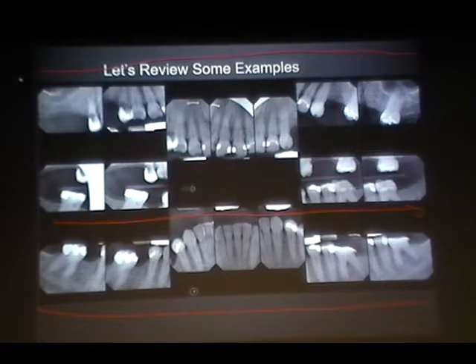Yes. They're also missing part of the crown, but the conditions are kind of difficult to get that, because it looks like they're missing all the teeth on the upper. So really, it's not even a necessary observation. So I'll answer your question. Okay, going back to your suggestion that the image is noisy. Do you think it's really noisy? Well, I guess not. That's the best image. Is it right?